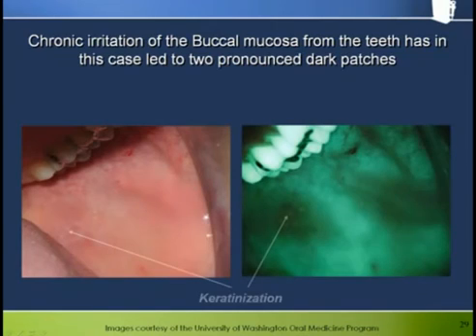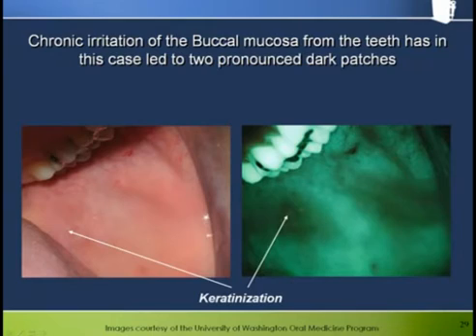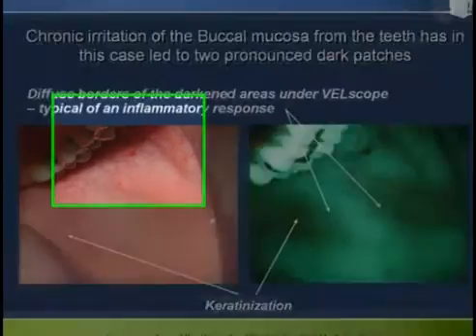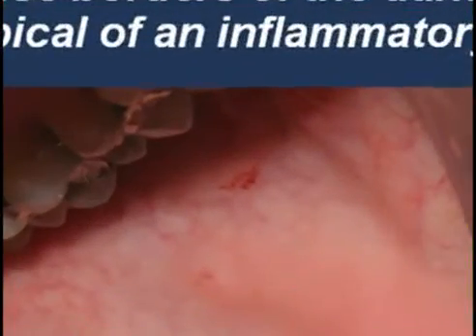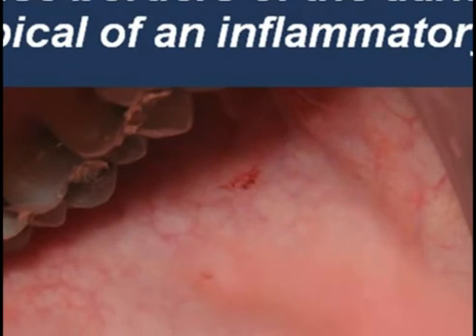Chronic irritation of the buccal mucosa from the teeth has in this case led to two pronounced dark patches rather than a line. The principle is still the same — notice the diffuse borders of the dark inflamed areas under Velscope. Also, the vessel damage with extravasated blood, associated with trauma, has a corresponding very dark presentation under Velscope, which is entirely to be expected.